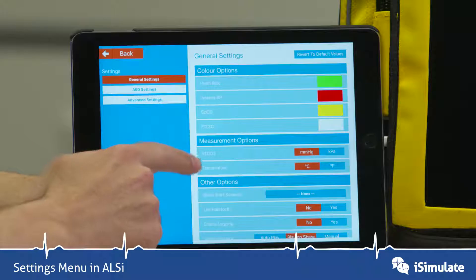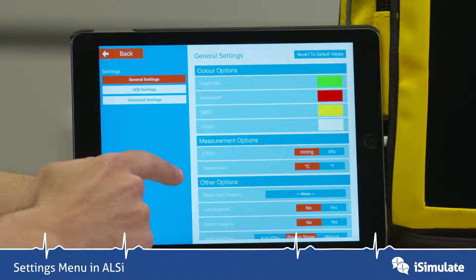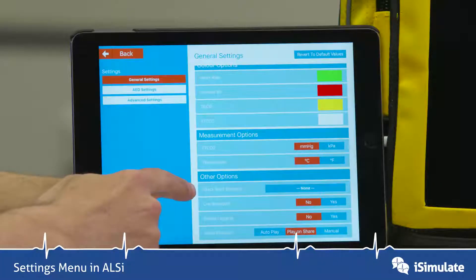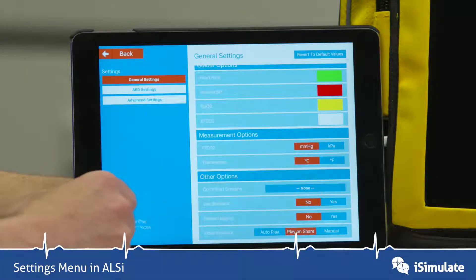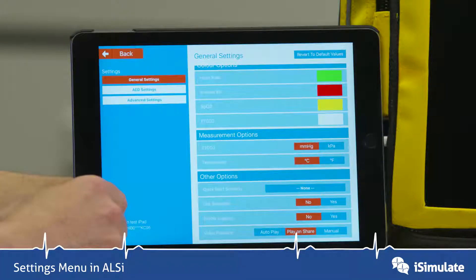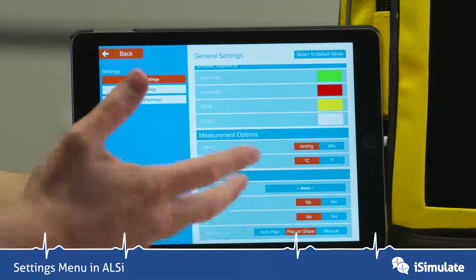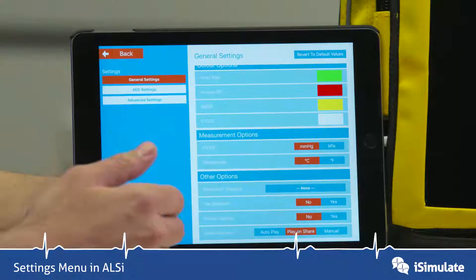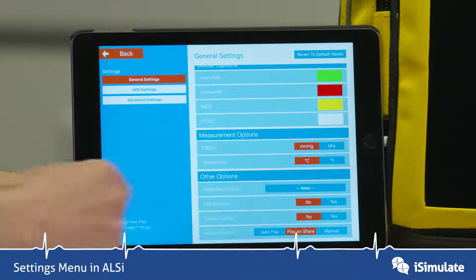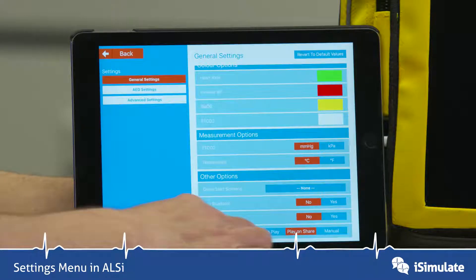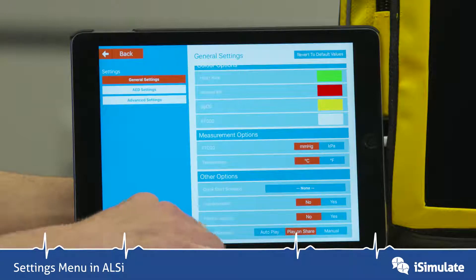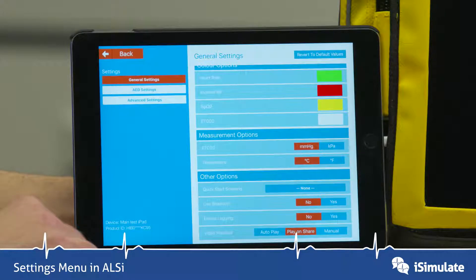You can also change the end tidal CO2 and temperature measurement parameters. There are other options such as Quick Start Scenario — you might want to change it to your own. The use of Bluetooth to connect iPads is usually recommended as a last-ditch attempt; we always recommend Wi-Fi. It enables you to log every single scenario instantly, and you can set video playback to auto, play on share, or manual — we would usually recommend play on share.